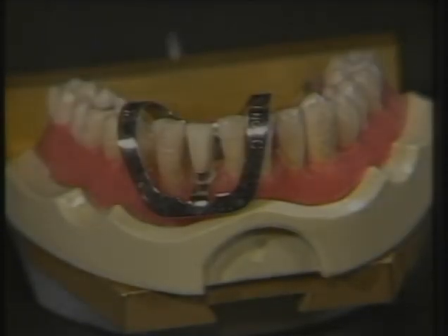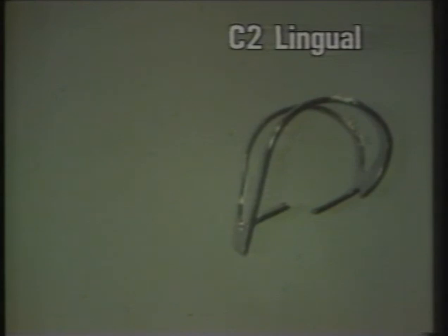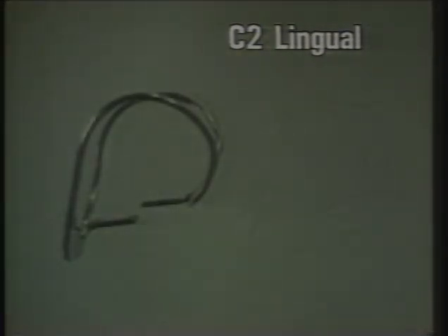The EW is universal for incisors, canines and premolars, and any of these last four clamps may be used for gingival retraction as well as for anchoring the rubber dam. However, for gingival retraction of a premolar, canine or incisor, where for example it is necessary to expose a cervical cavity, the regular double bow C clamp has been specifically designed. There are two additional versions, the C1 for deeply placed buccal cavities and the C2 for deeply placed lingual ones. But for most uses, the regular clamp will suffice.